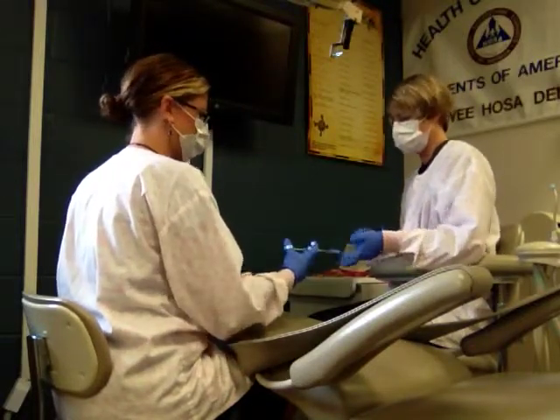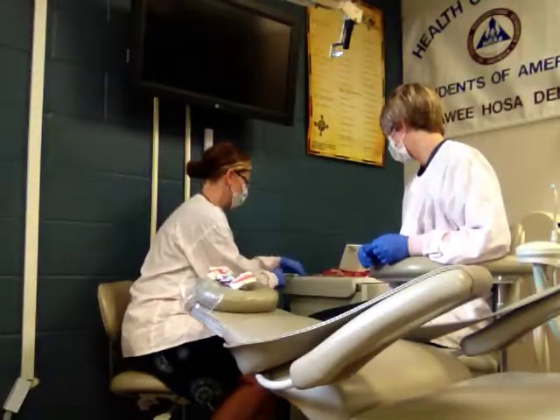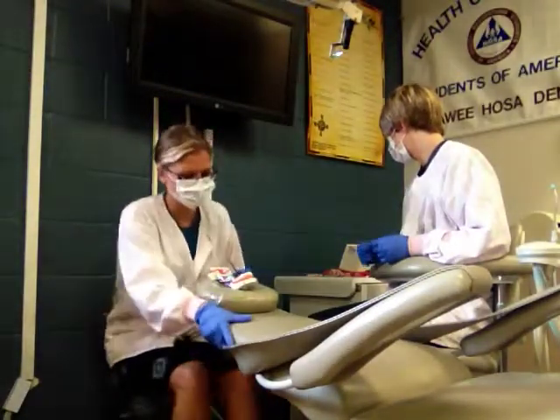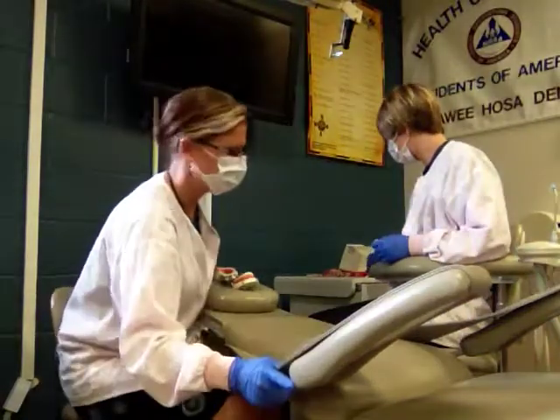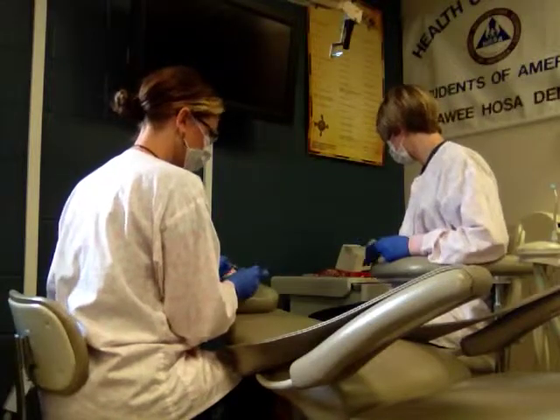We'll do the anesthetic. When the patient's numb, we'll use the high speed, slow speed, and HVE. Then we're going to use a spoon excavator to make sure we have everything all taken care of.